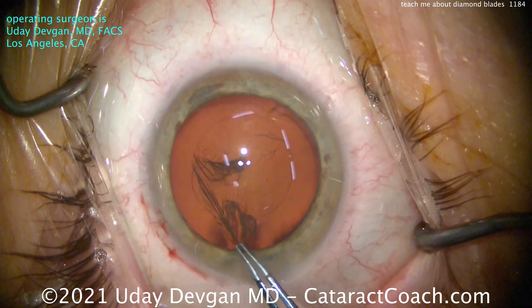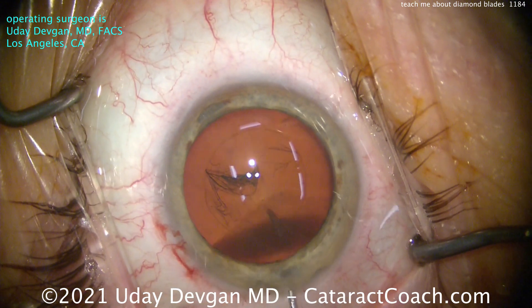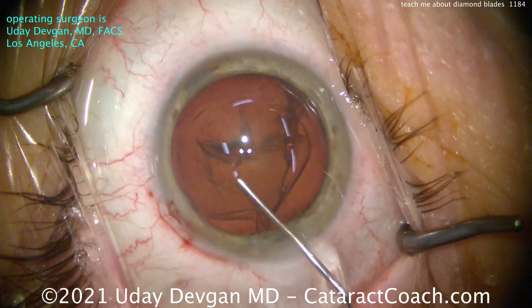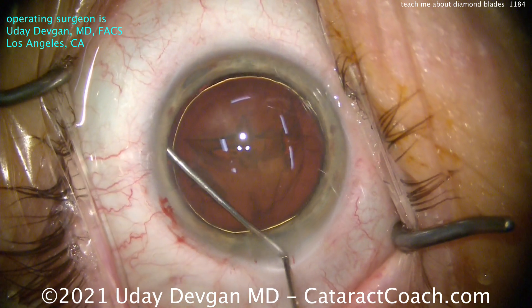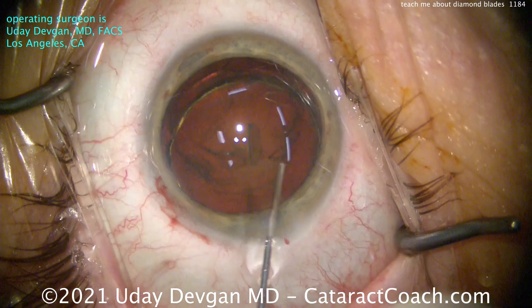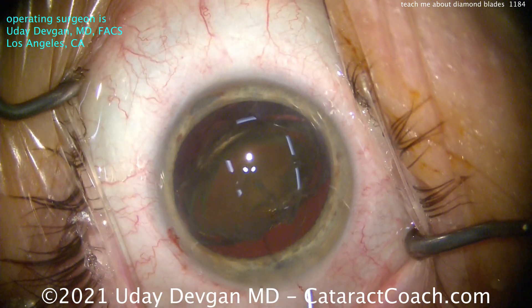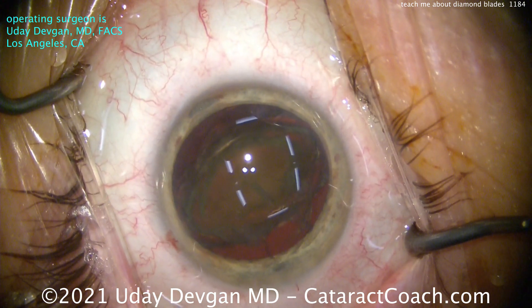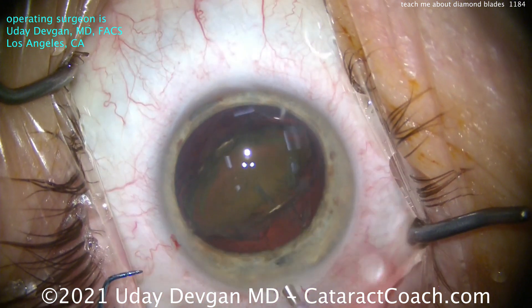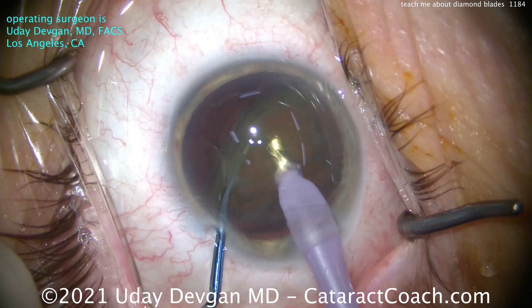The third technique is you can use a femtosecond laser. I know patients love the word laser, but of the many dozens of ophthalmologists on whom I've operated, not one has said you must use the femtosecond laser for my cataract surgery. I've shown videos on Cataract Coach of multiple ophthalmologists having surgery with me, and all of them have chosen a diamond keratome.